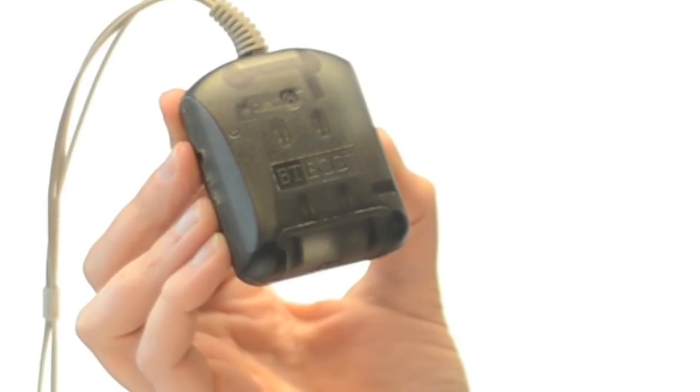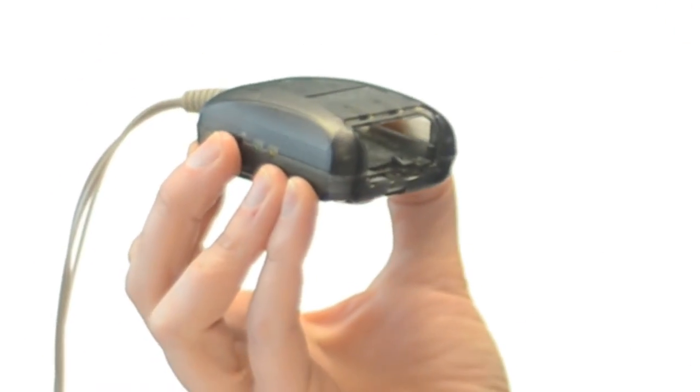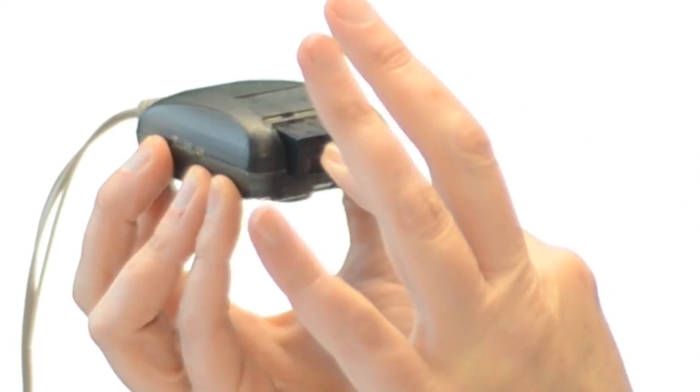Then place the monitor battery inside the heart monitor. Be sure that the gold plates on the monitor battery align with the gold prongs inside the monitor.